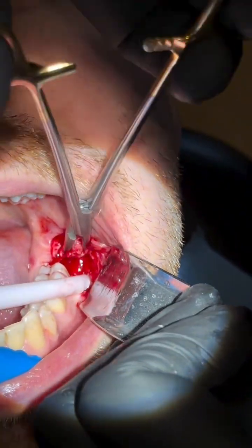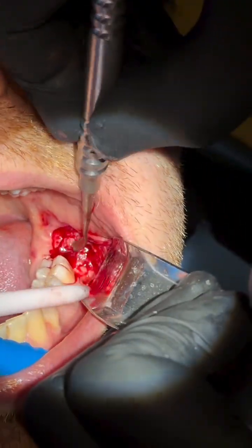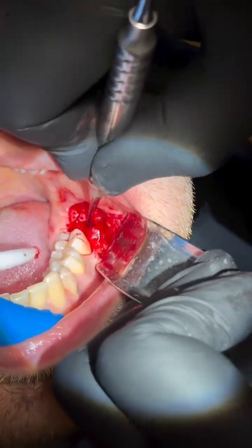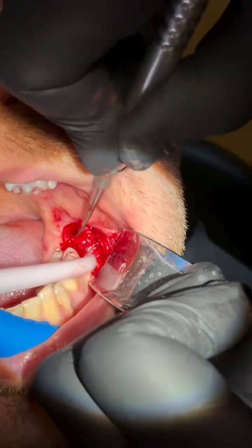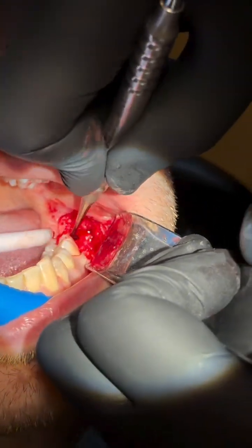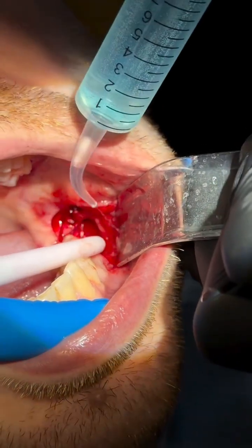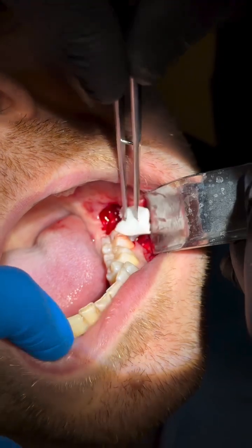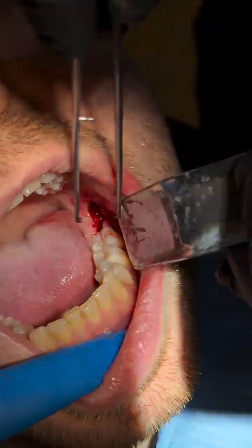Just make sure you clean everything. No cystic lesion left behind. Take your time. Make sure you don't curette blindly, as you may de-roof the IAN canal. Irrigate with saline the socket and also underneath the flap. Here I'm putting some hemostatic agent before I close.